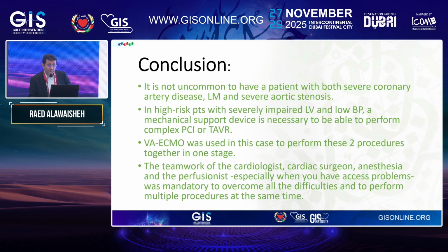My conclusion from this case is that it's not unusual to have severe aortic stenosis together with severe left main disease. In high-risk patients, prophylactic support is better, and ECMO was the option in this case. Teamwork is very essential to the success.